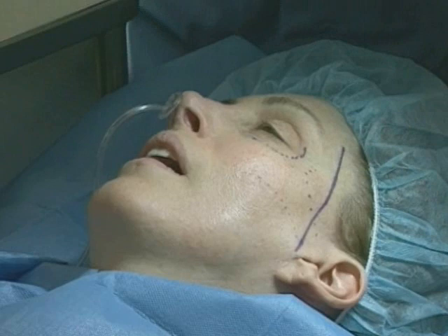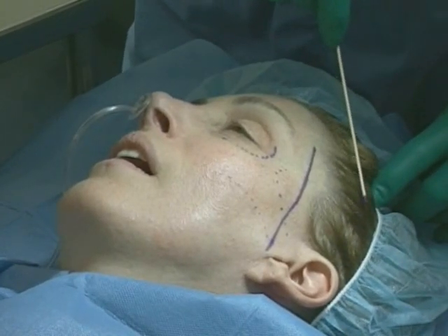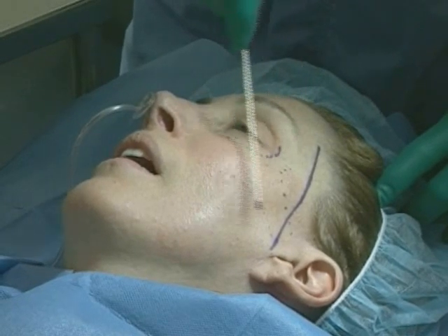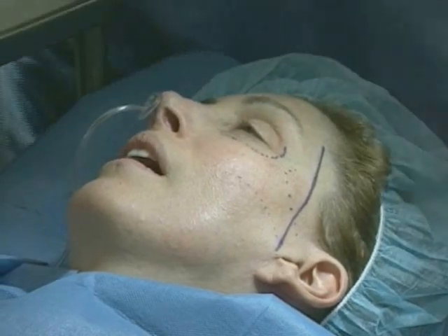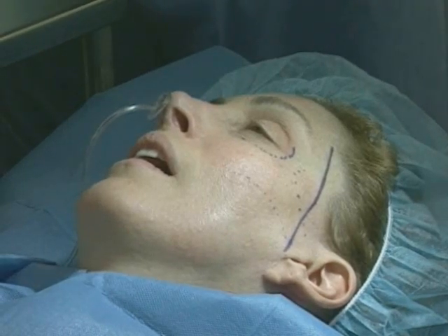We'll also inject in the temporal area where our cutaneous incision will be made and down along the lateral portion of the orbital rim to get hemostasis in this area. I then like to inject marcaine for the prolonged anesthetic effect.